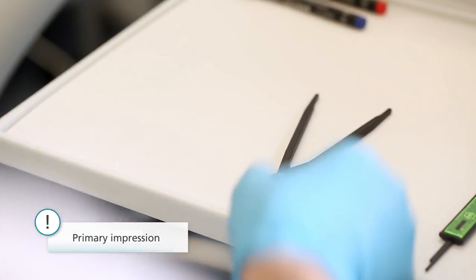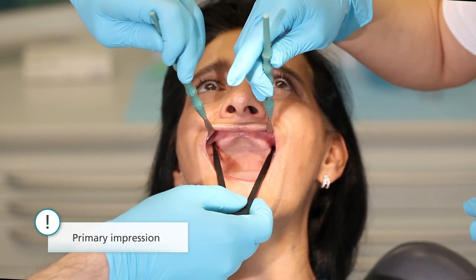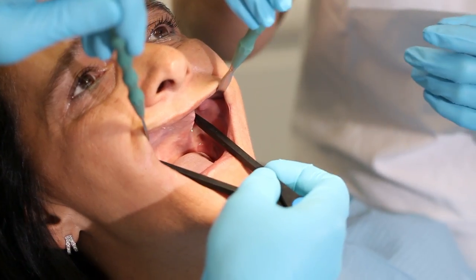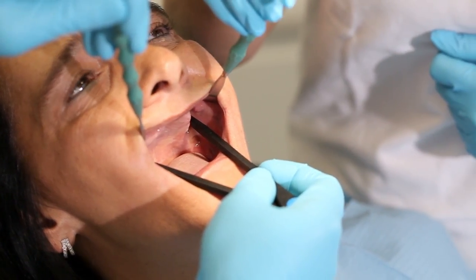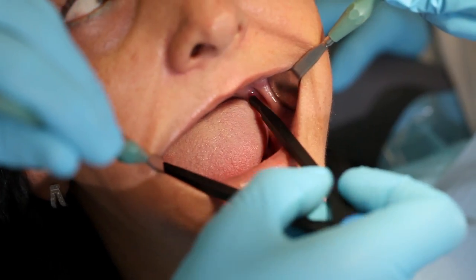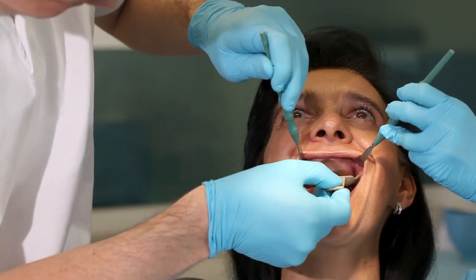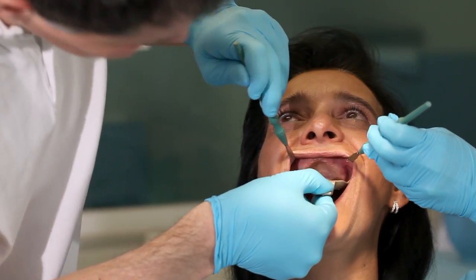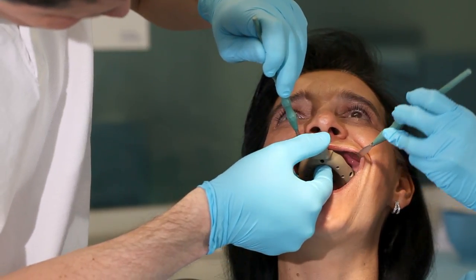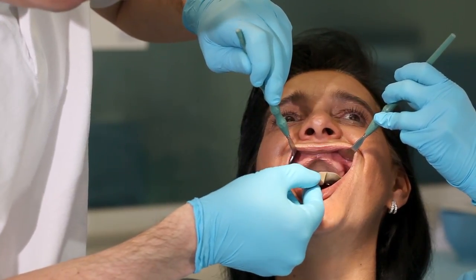Select a suitably sized tray, using calipers for this purpose. Measure the largest vestibular extension of the alveolar ridge in the upper jaw. In the lower jaw, measure the distance to the center of the retromolar pad. Now check the fit of the selected tray intraorally. There should be approximately 5 mm space for the impression material between the tray margin and the alveolar ridge.